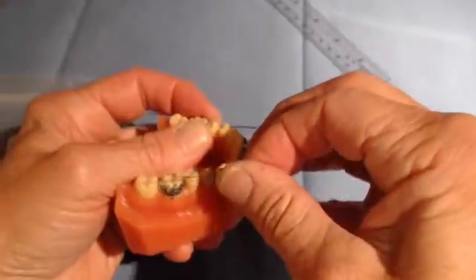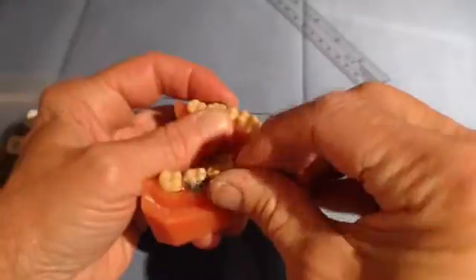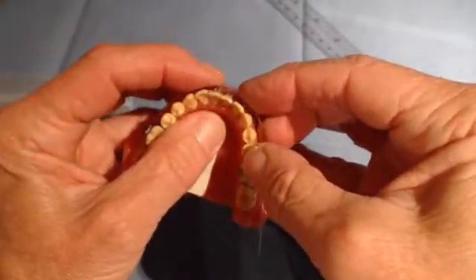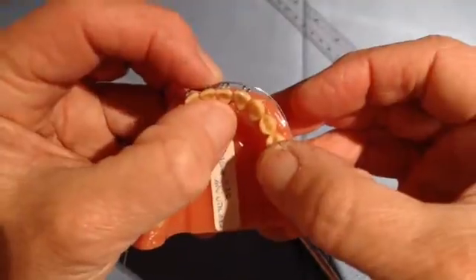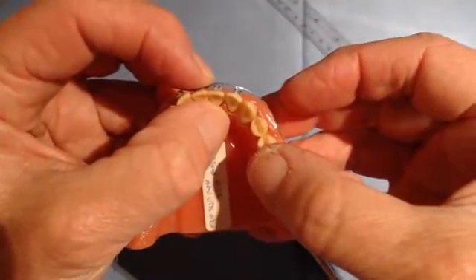Re-insert into the tube. You will see that the wire should be 1.5 to 2 millimeters away from the brackets, and when you engage that in here, you can see the force is going to advance the lower incisors.